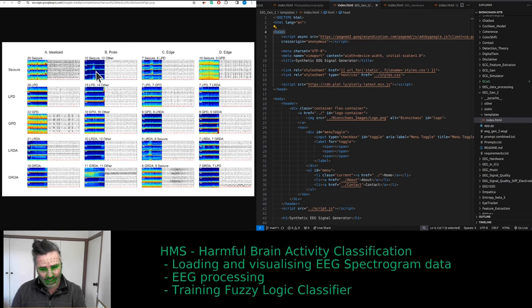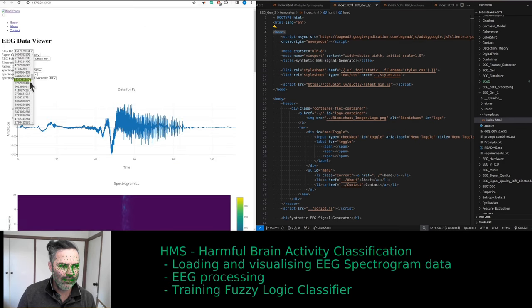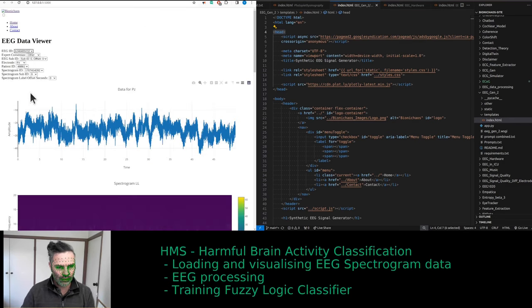That actually just has the raw data, just the raw EEG, what was recorded from the device. So not filtered or anything. One where we could generate the spectrograms out of it. So I don't know when they were labeling, were they looking at the spectrograms or at the time series, the raw EEG signal? Yeah, we might then not be using this dataset anymore.